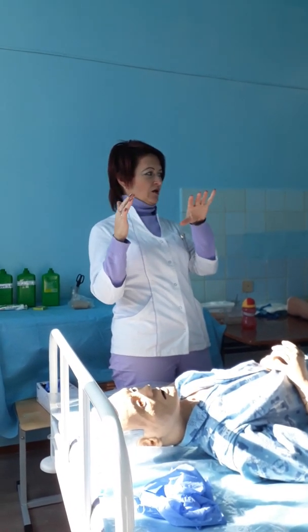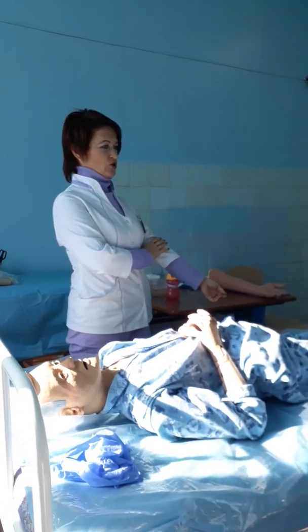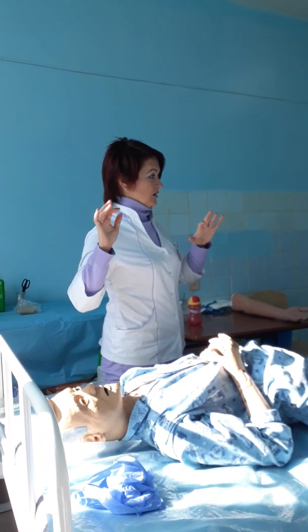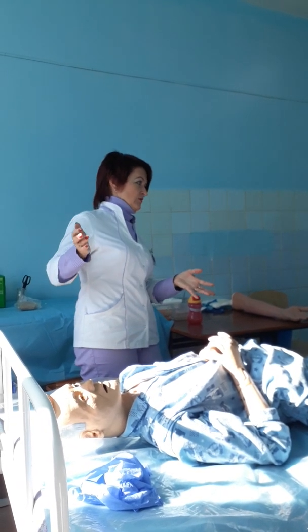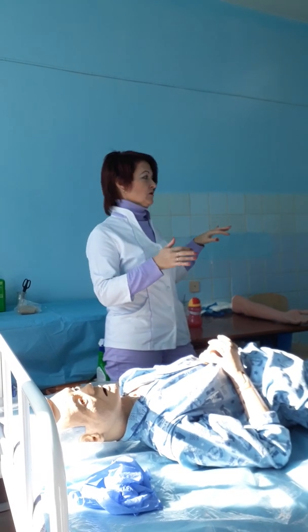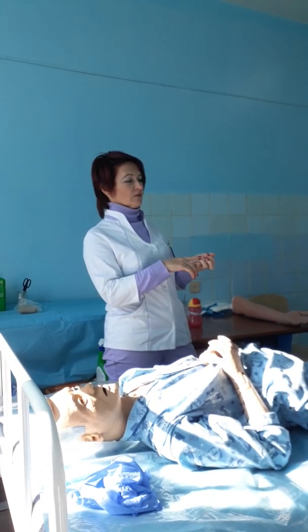It may be a different manipulation. For example, in the next classes I will show you collection of blood for analysis, or different catheterization, another manipulation, or it may be medicine. What information must you check? Name of the medicine, expiry date, dosage.